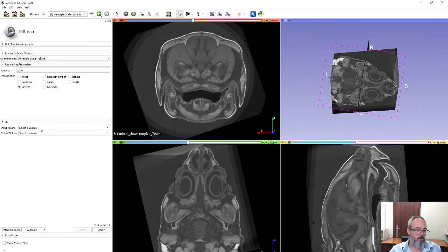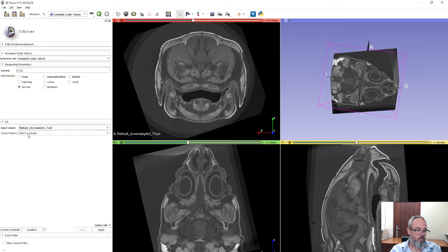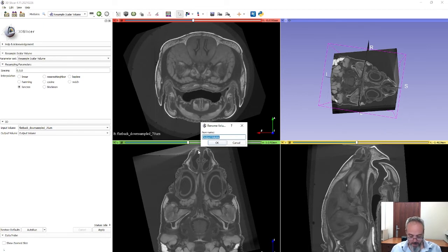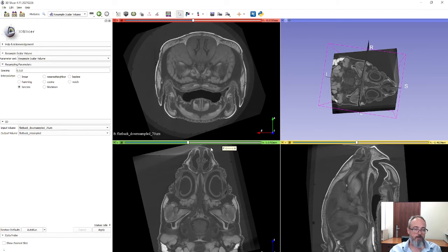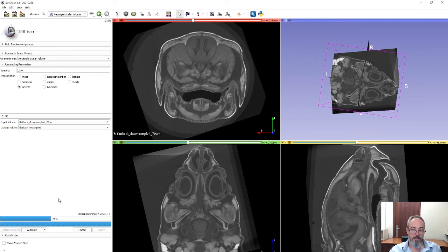Next, select the input volume, which in our case is the Flatback Downsampled data, and select an output volume. We're going to create a new volume and call it Flatback Resampled — or Reoriented, whatever you like. Once you've done that, click Apply. You can now see the process running; depending on the power of your computer and the size of the data this can take some time. This is a downsampled dataset so it's fairly small, and this computer is reasonably powerful.